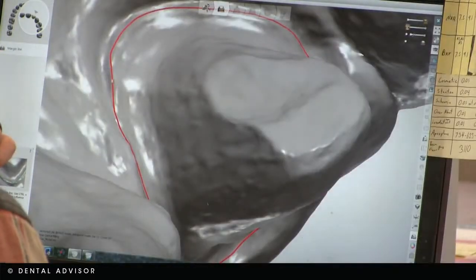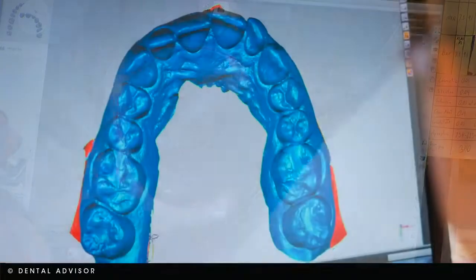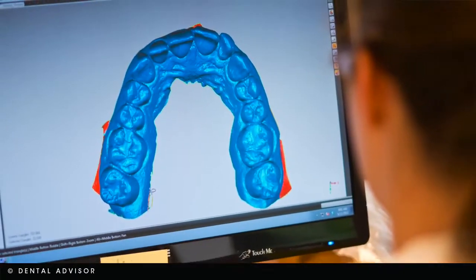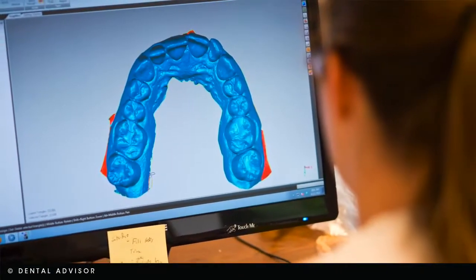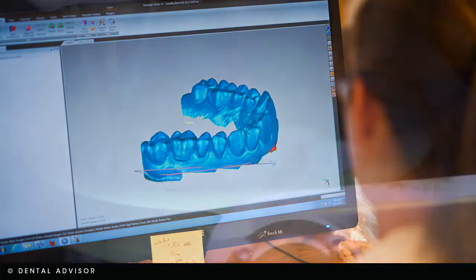From there, the file is used for design. Our designer will design the restoration, and then that file is sent to our camming station. At that point, the person camming will have to determine and confirm the material again, because we have all the different choices.